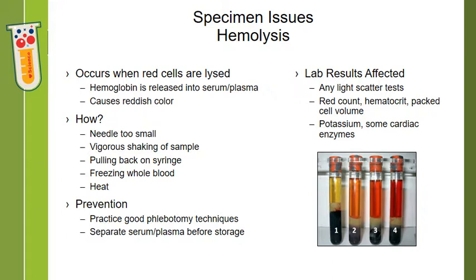One of the most common specimen issues we see in the lab is hemolysis. Hemolysis occurs when red blood cells are lysed, the hemoglobin gets released, and the serum or plasma turns a reddish color. You can see in the image the varying degrees of hemolysis, with the number one tube being little to no hemolysis, and the number four tube being grossly hemolyzed.